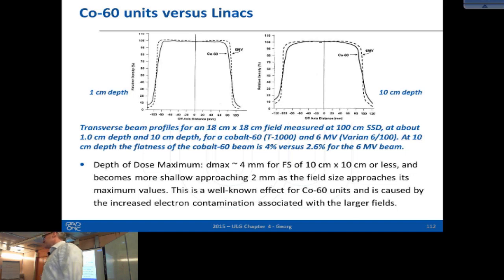If the planning system is capable of calculating the adequate dose, then what can we cope with? Let's assume that's there, but being able to draw sharp lines means that having sharp slopes cannot be a disadvantage. But there could also be cases where you really want to use the penumbra. Of course, it's not a sharp line, and you have some kind of modulation of the beam intensity. You don't think it matters for conformal treatments? Why? Because in intensity modulated treatments, we optimize with what we have. We also see that this flattening filter treatment quality can be... Yeah, that's an argument.